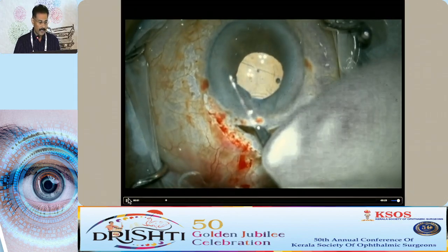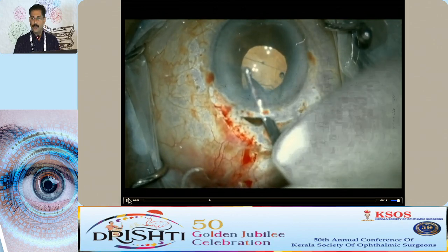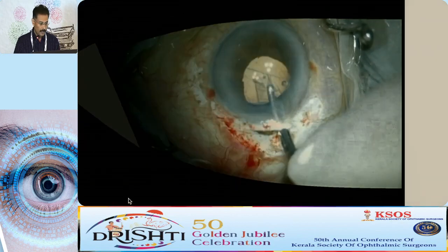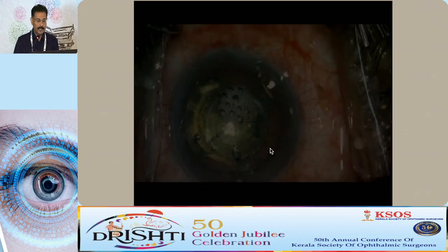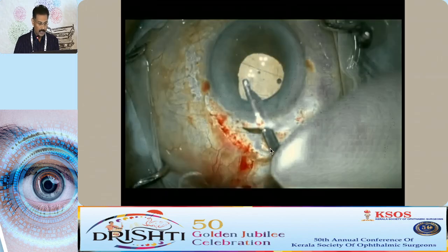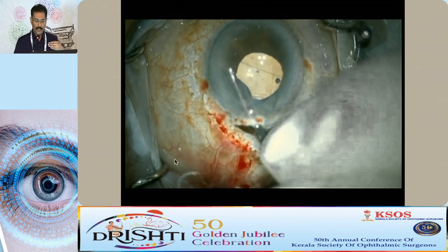So this is another dreaded problem which can happen. This is an SICS wound, but still, when you manipulate some incisions in phaco also, you can get this kind of a DM stripping. So this DM stripping is a bad thing to have. Even last week, one of our trainees had it, and mostly it is from the incision site.